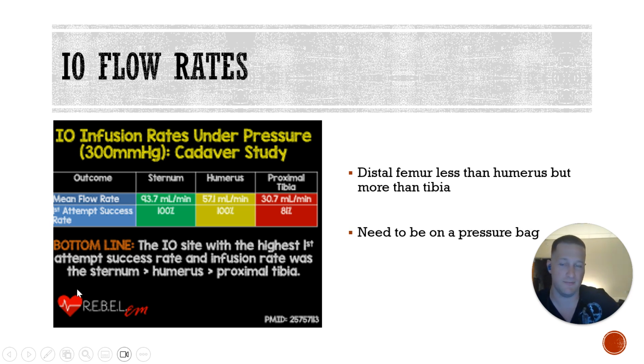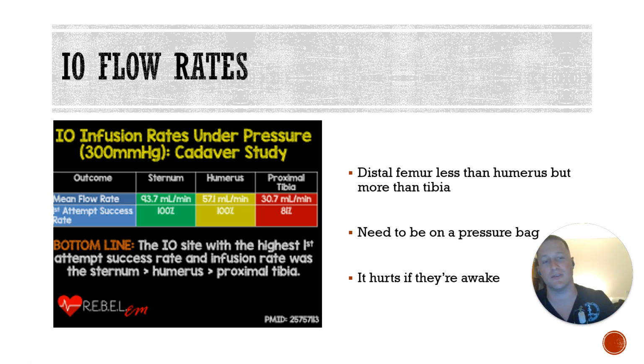This is a great foam website if you want to look at it, Rebel EM. But the IO needs to be on a pressure bag, or it's just not going to flow very quickly. And then if they're awake, it's not the drilling of the IO that hurts, it's the infusion of fluids into it. And so it can hurt pretty significantly when they're awake. You can put a little bit of lidocaine in there, but that's kind of a more nuanced approach. You're putting the IO in because they're really dying.